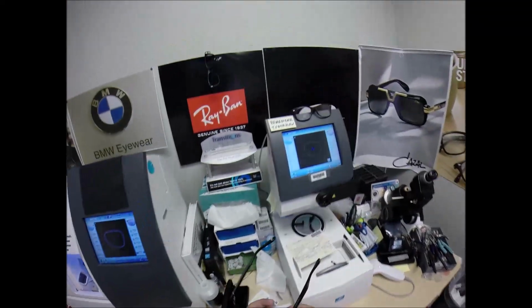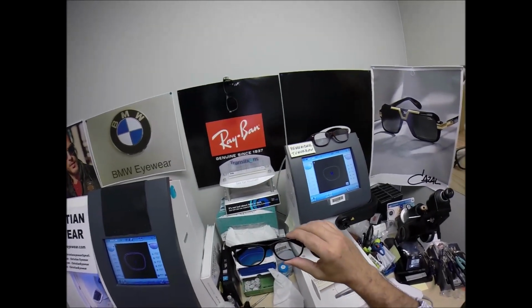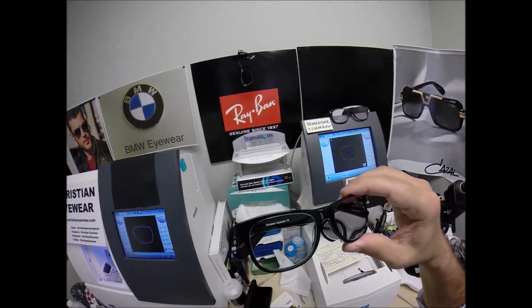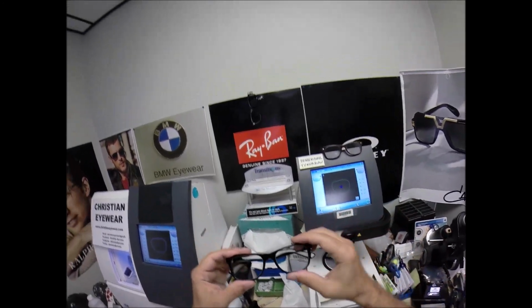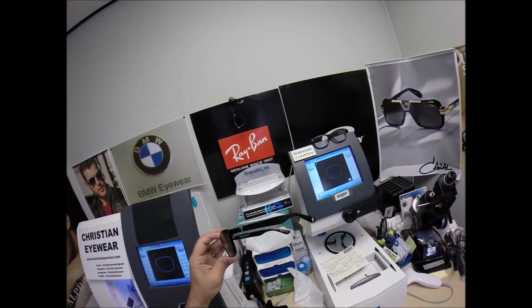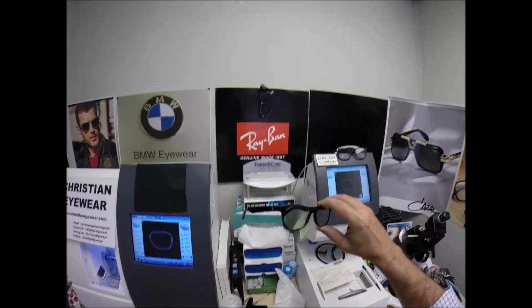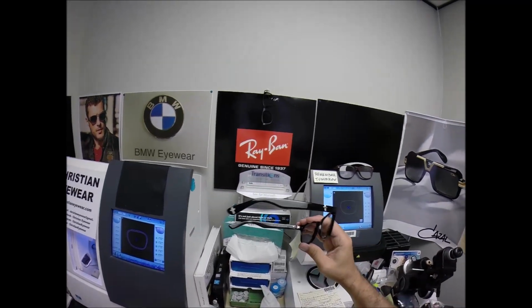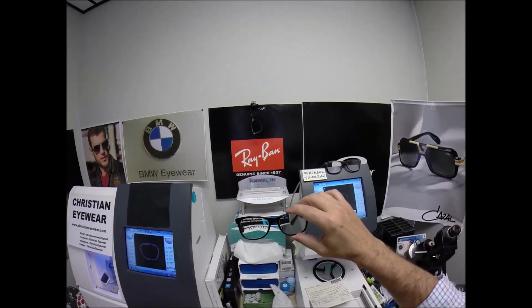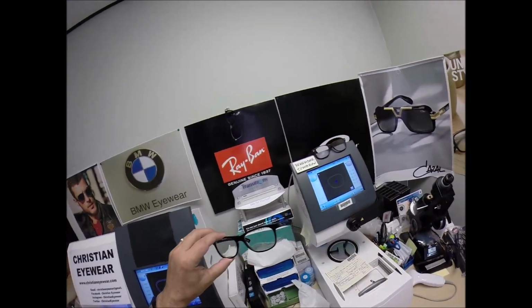But as you will see, all photochromic transition lenses will turn dark on day 1 and continue to darken every day for the first couple weeks they are exposed to the sun. After that, they will work for years at maximum performance. The only time that photochromic transition lenses will not darken is if you're behind the windshield of a car. Your windshield absorbs the sun's harmful ultraviolet rays that would cause your dashboard to crack from sitting in the sun all day, and that's why they don't turn dark in a car.